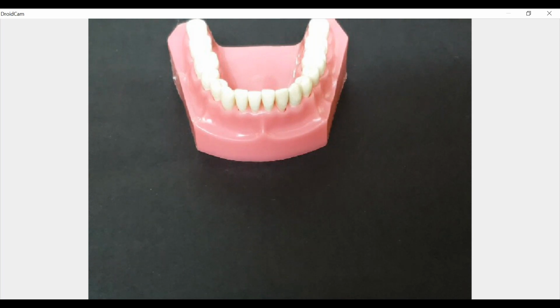Once you have determined the condition of the tooth, you will select the clamp, and once the clamp is chosen, you will go ahead and anesthetize the marginal gingiva. You will lubricate the interdental spaces with a lubricant. It could be KY jelly, it could be a shaving foam, it could be a liquid soap, anything which is water soluble. And then if required, you will perform pre-wedging, which might be essential for restorative procedures.